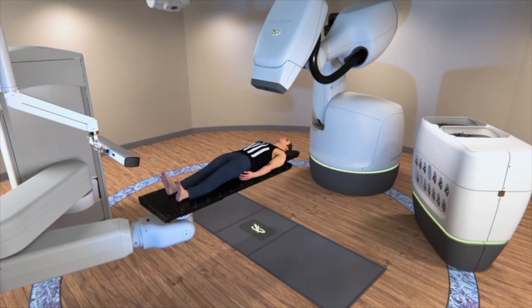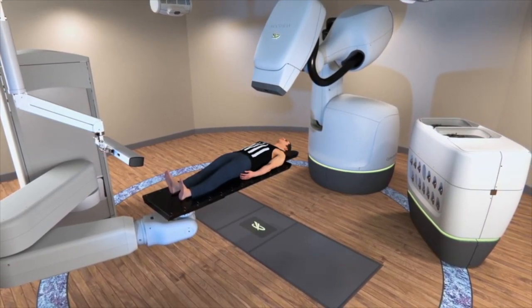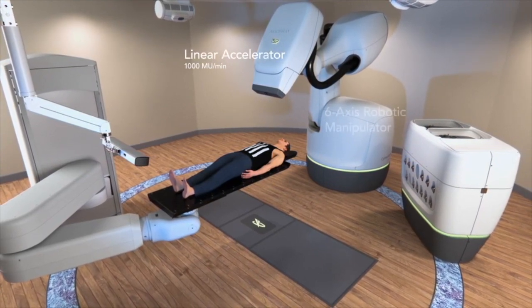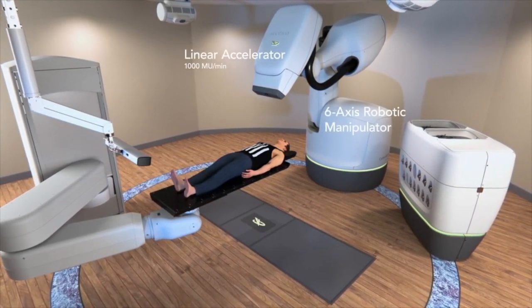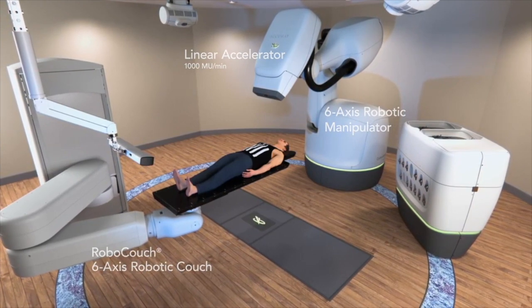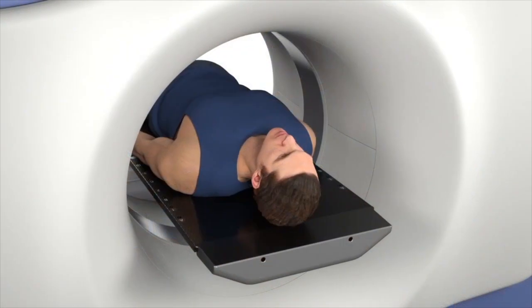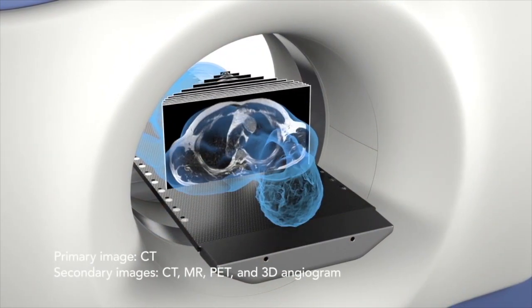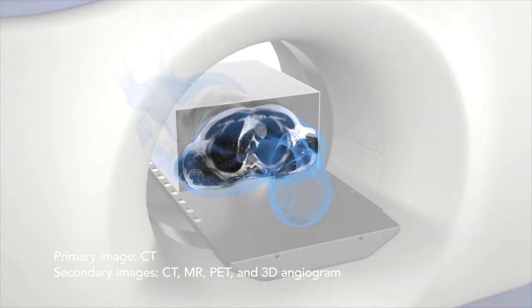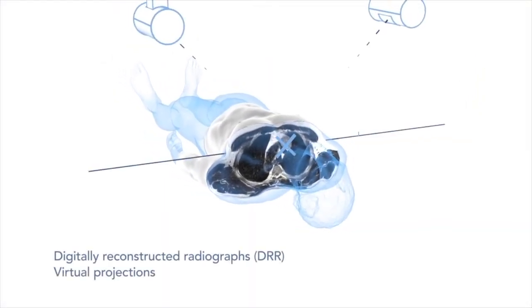The CyberKnife system leads SRS and SBRT innovation. Its unique architecture — a linear accelerator mounted on a 6-axis robotic manipulator — enables unmatched precision and versatility anywhere in the body. The patient workflow starts with a CT acquisition, the primary image for treatment planning. Digitally reconstructed radiographs are then generated by the CyberKnife system.